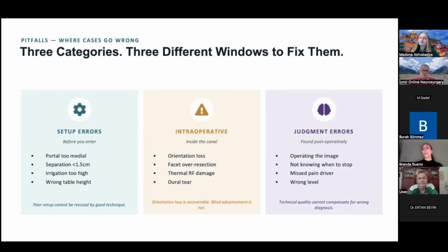If it's more than 1 centimeter, I do a suture. Of course, if you don't have the experience to do that, convert to open or tubular surgery. But if there are no neural structures as content and you can reduce, you follow the same as I said. If it's impossible to reduce, you need to convert to tubular or open, depending on your experience.